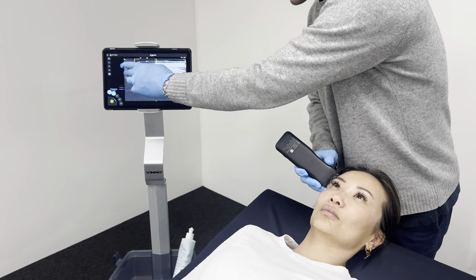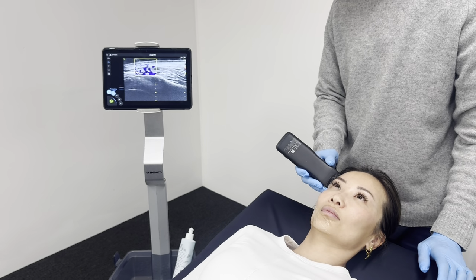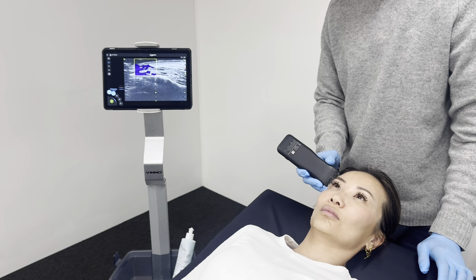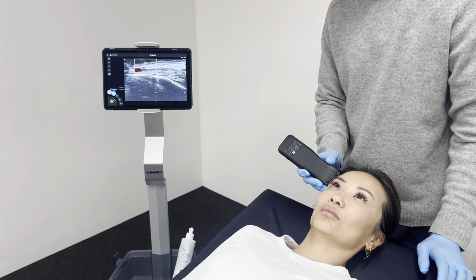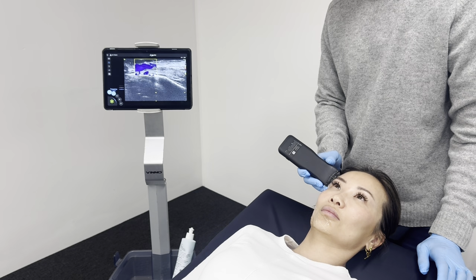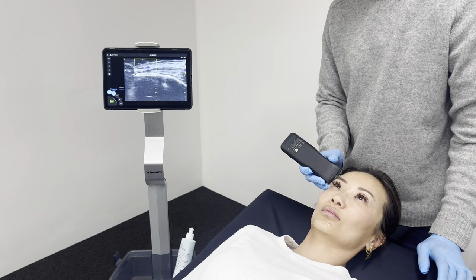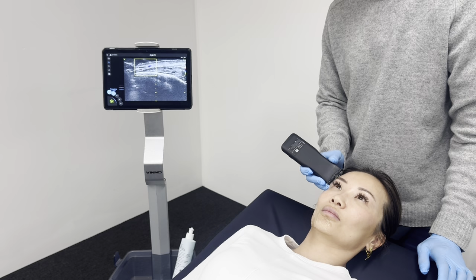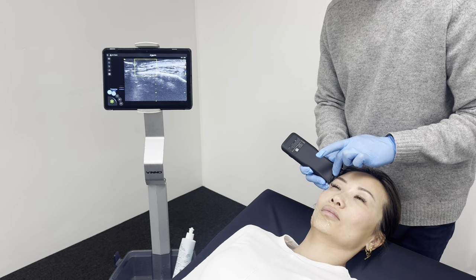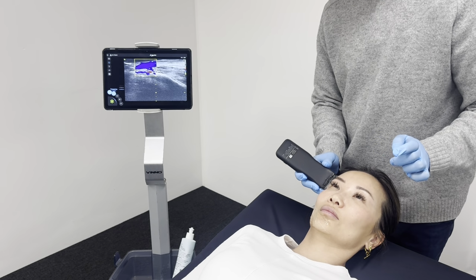I'm going to turn that gain down a bit more. See some of these more superficial structures. There we are. And you often need to do a bit of tilting and rocking to find those superficial vessels, which you can see there. I'll just put that into the middle of the screen. That's probably just around this area here in relation to the marker.